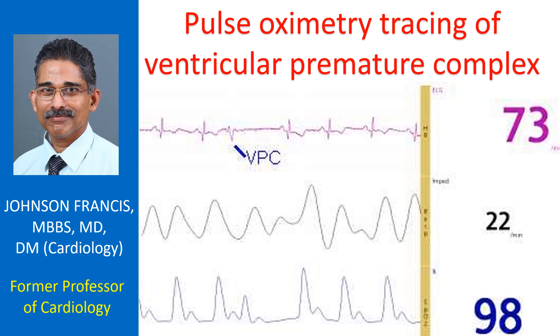A ventricular premature complex followed by a compensatory pause has been marked below the tracing. The VPC has a wide QRS and does not have a preceding P wave.